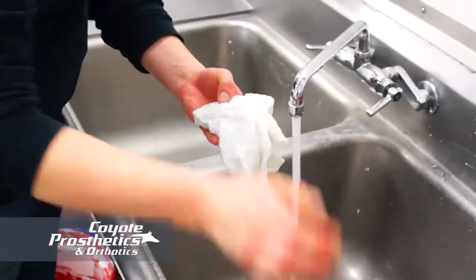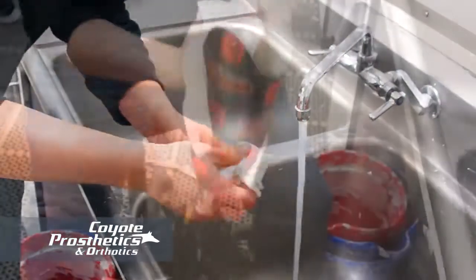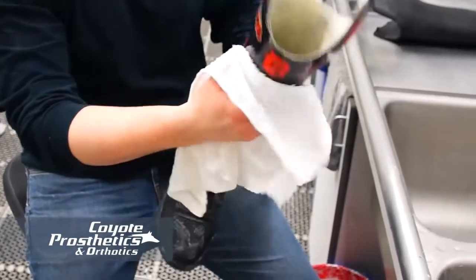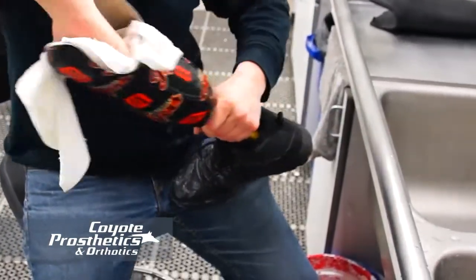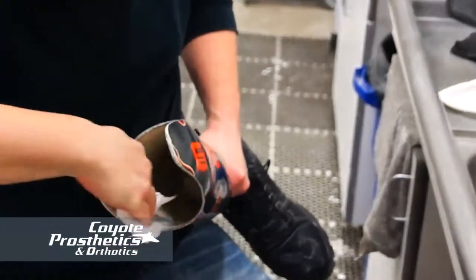To clean your prosthetic, if you get dirt on top of it or dust, anything like that, you can take it and just wipe it down with a damp cloth. And you don't want to use too much water, just so that it's nice and damp. You don't want to be dripping into any of the components or anything like that.